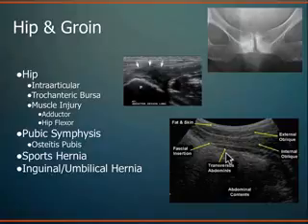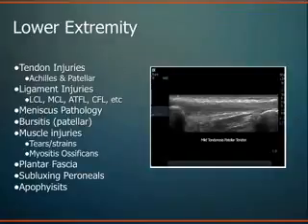quite well with ultrasound. Another very common source of pain in the groin, in athletes particularly, is osteitis pubis, or just chronic changes at the pubic symphysis, inflammation. And the best way to work through your differential on that is to inject it. It's obviously a sensitive area, so you want to have image guidance to inject. You can see it quite well on ultrasound and use ultrasound guidance for those injections.